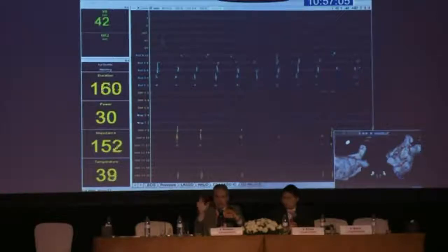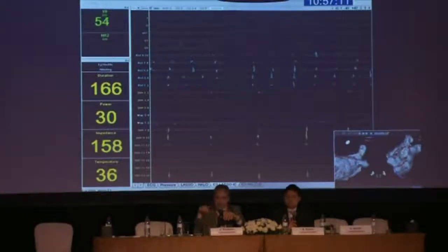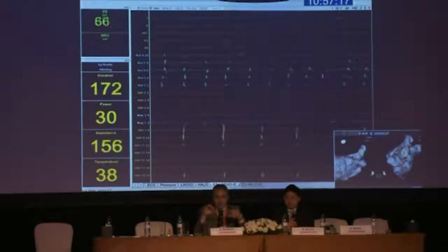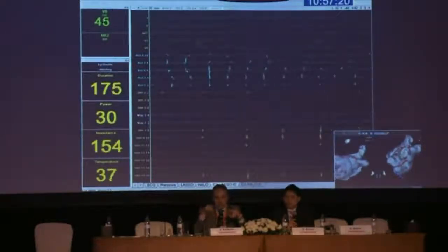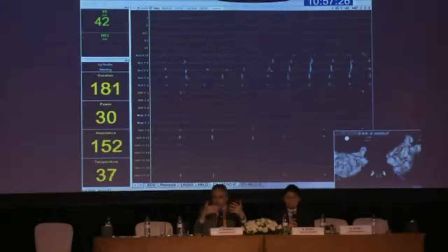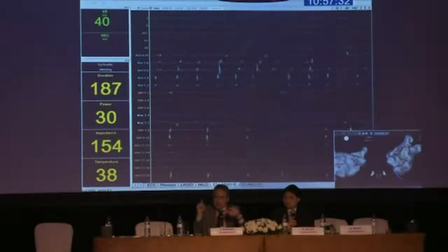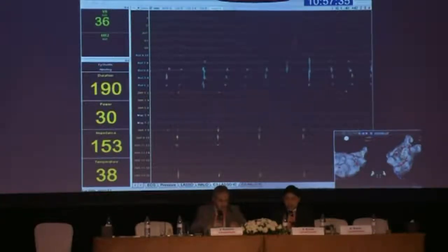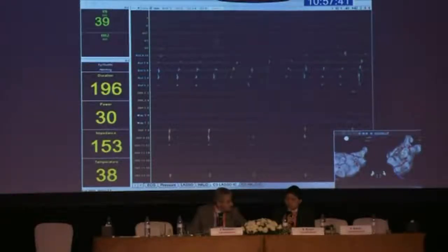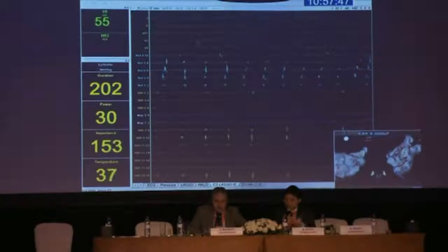But still, I believe now with data we have from clinical experience, we always do a circumferential line, despite the fact that you have isolation after, let's say, ablating only 1/4 of the vein. Because if you leave visual gaps, they can reconduct, or conduction can occur because you have some muscle there. So I think it's a much better strategy to do this kind of circumferential ablation. And then in the very early data from Bordeaux in segmental ostial isolation, it also depends on your lasso position. If your lasso is quite far in, you can ablate in remote areas that are not early, and yet you get PV isolation.